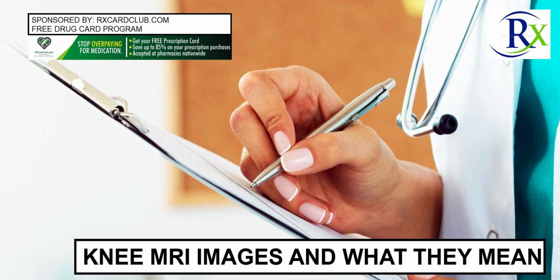A tendon is a tough, sinewy fiber that connects muscle to bone. 2 tendons are seen on an MRI. An MRI can be used to detect chronic tendinitis or tendon ruptures, although this is usually apparent on physical examination.